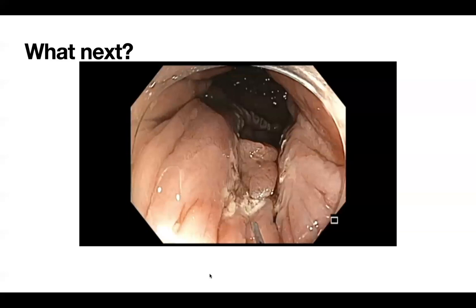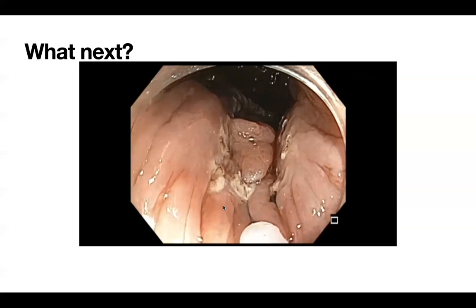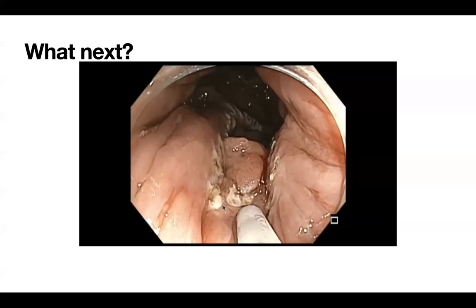So one of the things that I wanted to share here is we had a PAP conference last week, I think, and we were talking about resecting low rectal lesions, and that's one of the reasons I brought this case. So when you have a low rectal lesion like this, when it comes to injection, you want to use the needle parallel to the lining, but not at an acute angle like we use for submucosal dynamic injection.